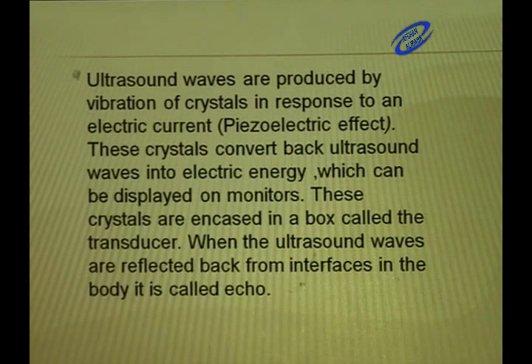Like these crystals can convert electrical energy into sound energy and the sound energy back into the electrical energy. This electrical energy can be displayed on the ultrasound monitor. These crystals are encased in a box which is known as a probe or transducer. When the ultrasound waves are reflected back from the interfaces in the body, these reflected sound waves are known as echoes.